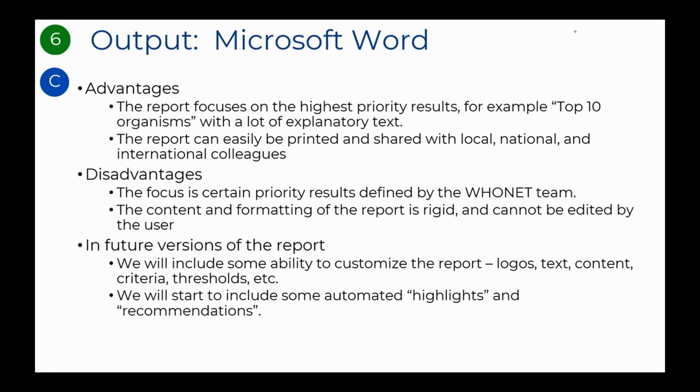For example, we plan to offer some ability to configure some features of the Word reports, such as logos, text, and filtering criteria. We also plan to create a new section for highlights and recommendations.